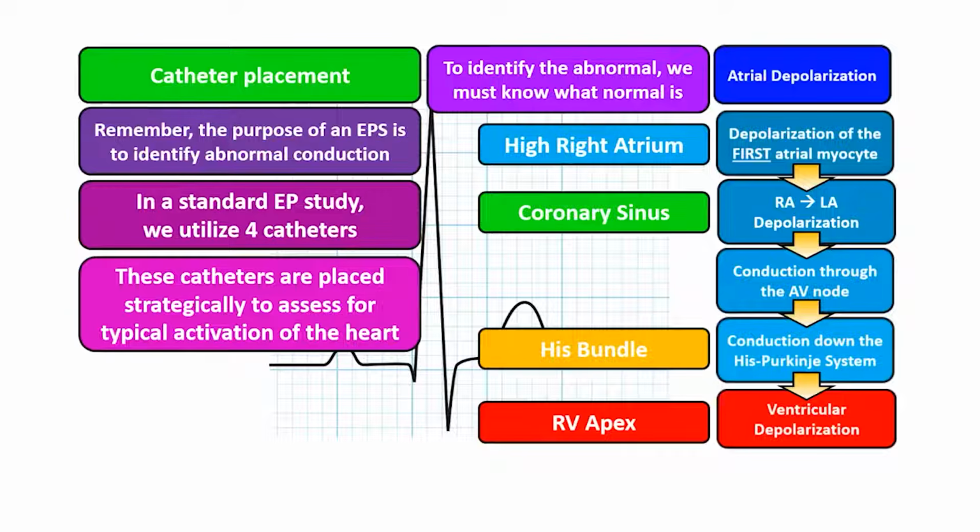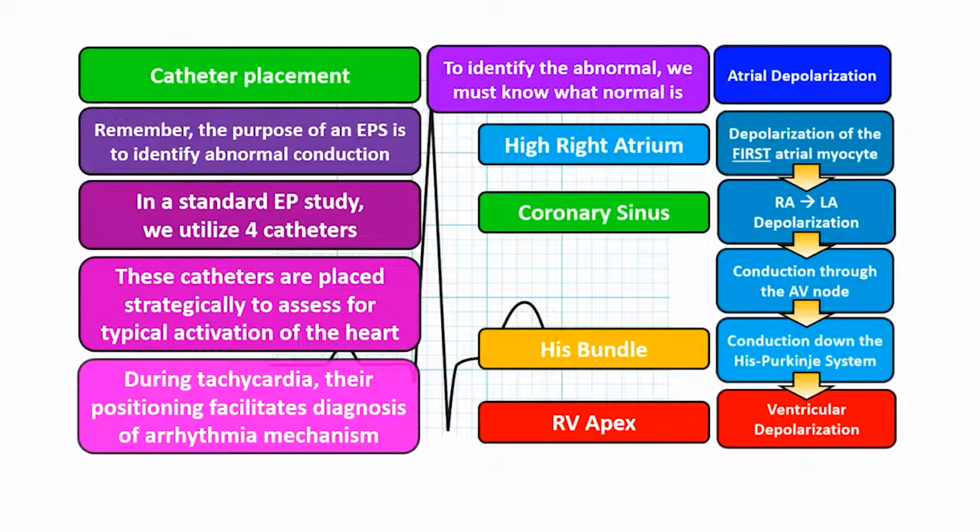These catheters are placed strategically, once again, to help us assess for typical activation of the heart. And during tachycardia, the positioning facilitates diagnosis of arrhythmia mechanisms.